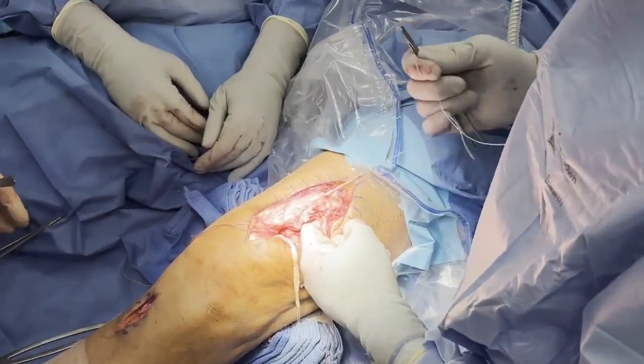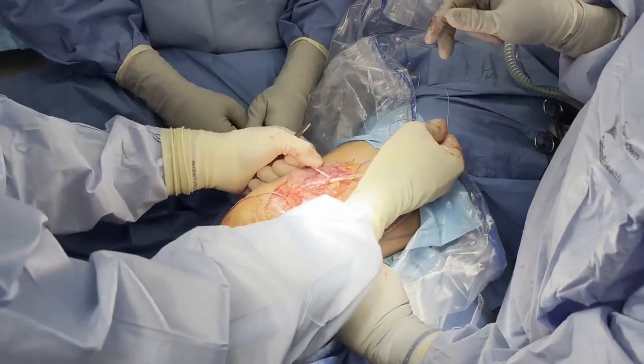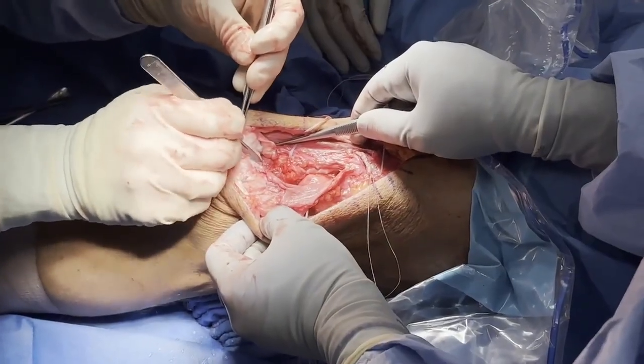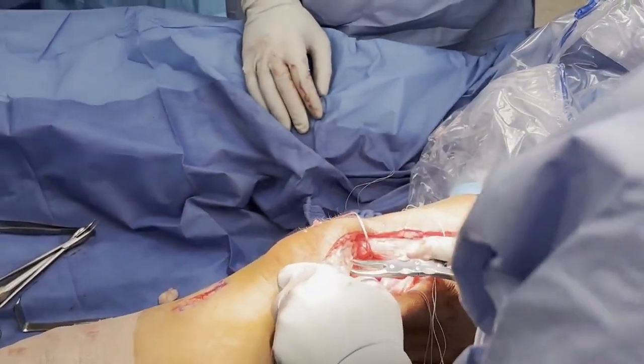Both limbs of the autograft are then passed into their respective soft tissue tunnels. The superior pole of the patella is then decorticated with a rongeur and scalpel, removing remnant quadriceps tendon and the failed sutures from the previous repair.